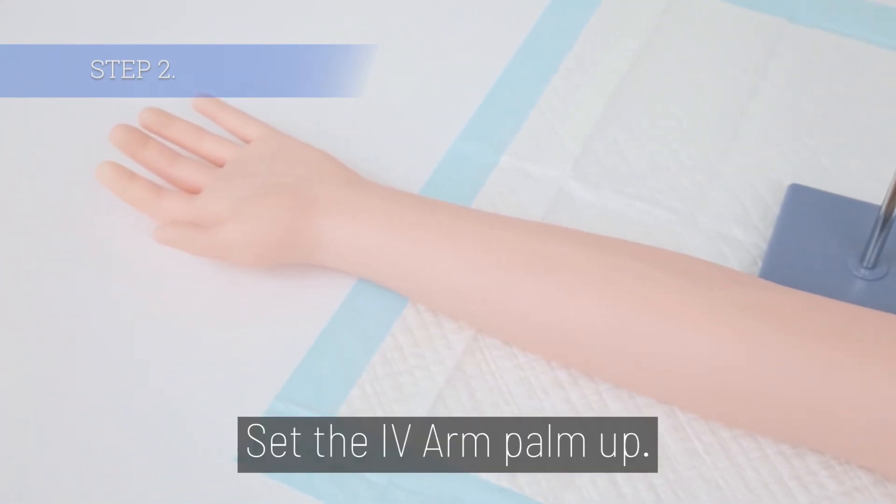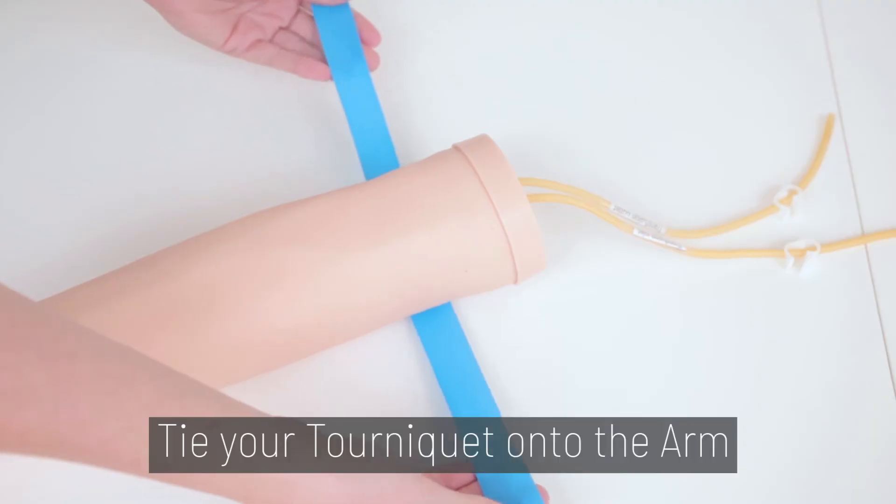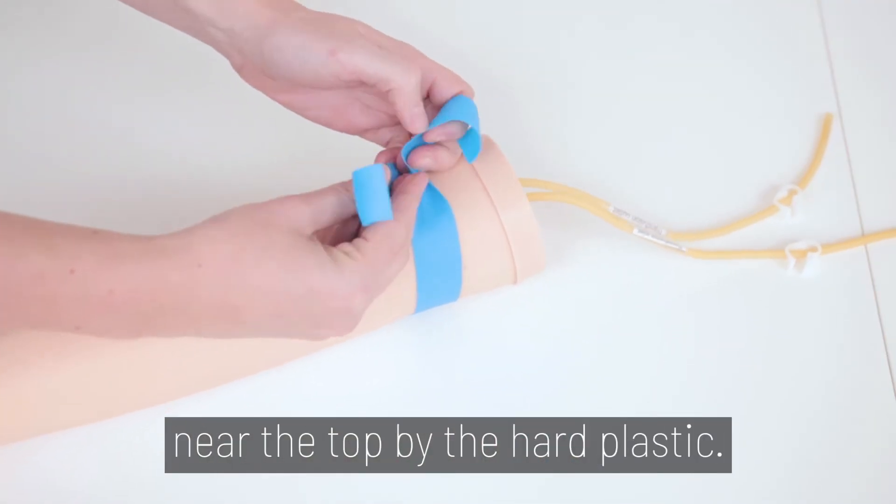Step 2. Set the IV arm palm up. Tie your tourniquet onto the arm near the top by the hard plastic.